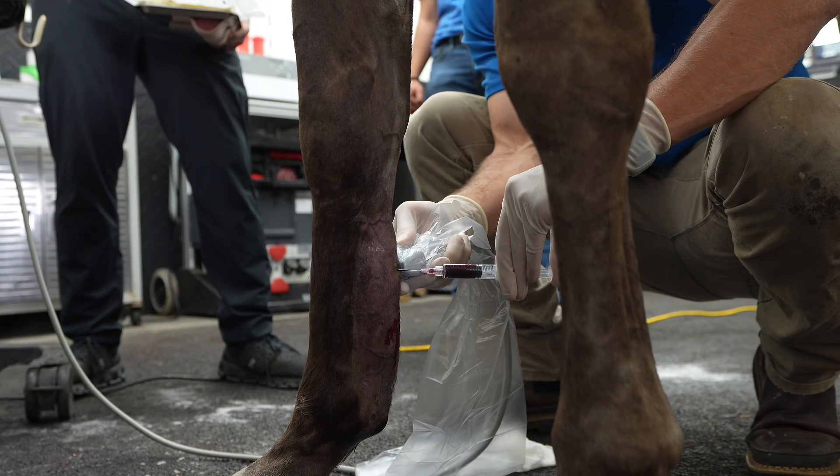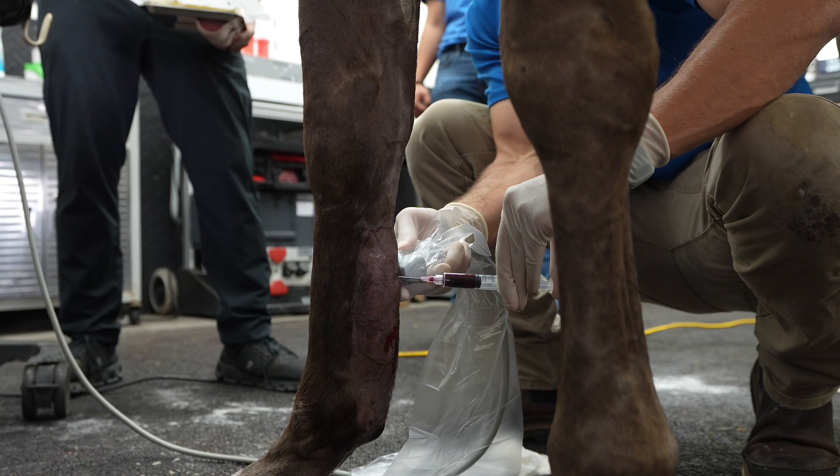After PRP, we performed shockwave. For the PRP, we draw the horse's blood, extract the platelets, and put them right into the tendon. This brings the body's own ability to heal — the platelets contain growth factors and anti-inflammatory properties that help the body heal itself.